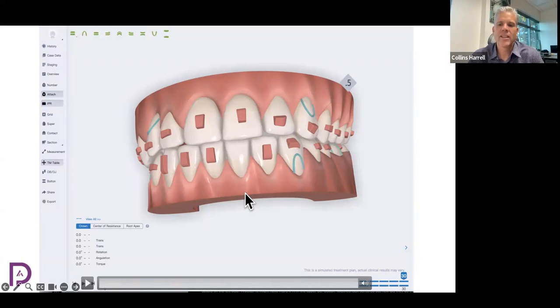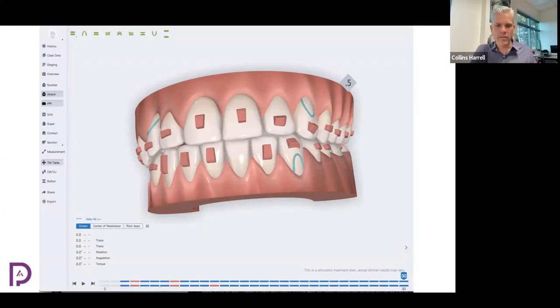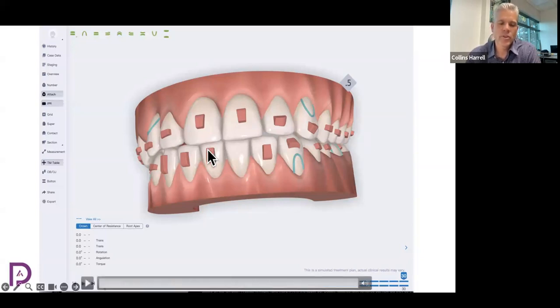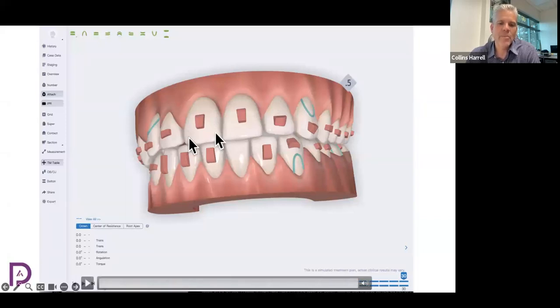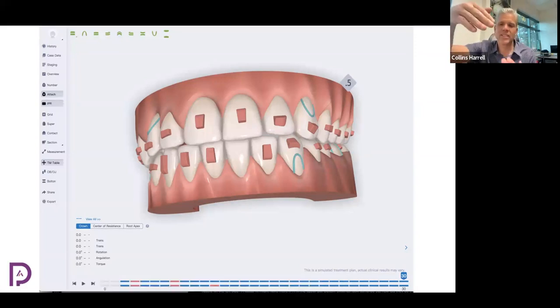So just wearing the aligners for a patient who has moderate to strong muscle strength, they tend to intrude their posterior segments as they wear the aligner. So as they bite down with the aligners out, they're going to get more overlap of the front teeth, which is why sometimes in our aligner cases, we end up with a closed front bite and a slightly open posterior bite that we have to deal with in refinement revisions.